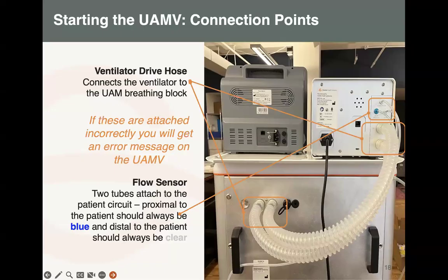Understanding the AA and the BB is important because we will see later, when doing the flow sensor calibration, you have to use either of them, where it is AA. So it's this. I know those who have used the previous machine, this is kind of a modification, but this is how it should be connected.